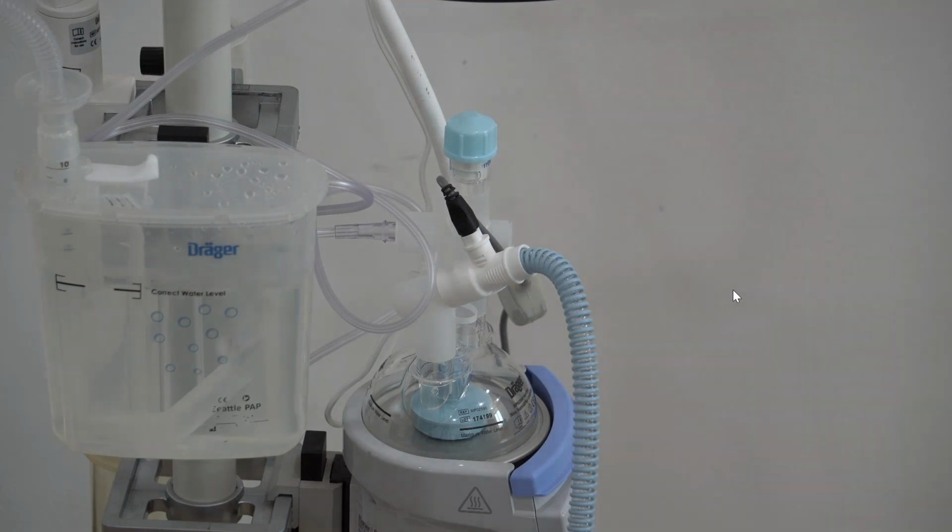I have to add that, from the reprocessing perspective, we have guidelines on how often the circuit needs to be changed, and it's exactly 7 days. But when it comes to water, I will have to investigate this a little bit further, and I will get back to you on this topic. Yes, and I'll also look at it. It's not a problem. We can give it in the recap section next time. Yes, we will refer to it in the recap section next time. Thank you, Linda.